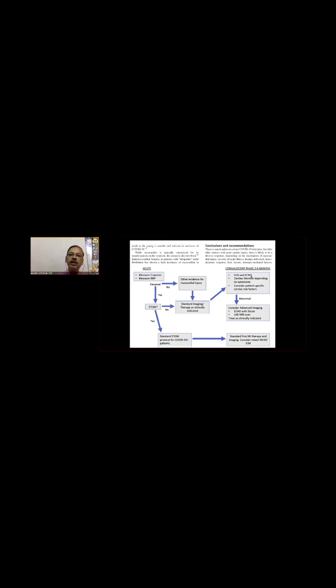But in certain situations, the bullseye will give you the trick. Regional strain values have not been standardized, how much you should regard as normal and how much abnormal. Global longitudinal strain is now standardized, but regional longitudinal strain is still not standardized. So that's why you can go with that.